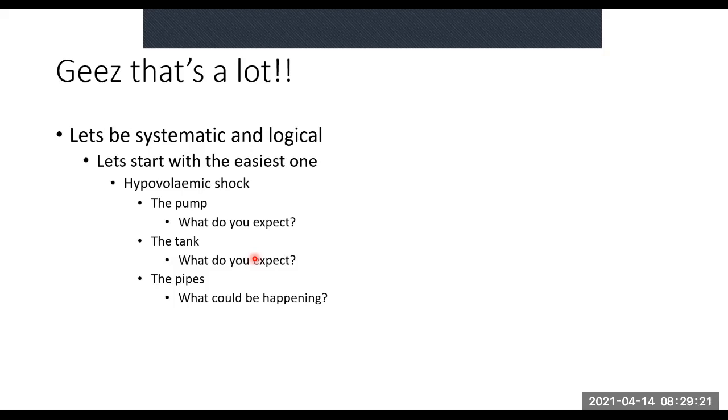Okay. So what do you expect in the inferior vena cava? Now remember, we covered this a few weeks ago when we were talking about fluid assessment, right? So the vena cava, if you have sufficient amounts of fluid, every time you breathe in, it should contract a little bit, but not too much. Agreed. If you have too much fluid, it shouldn't contract.